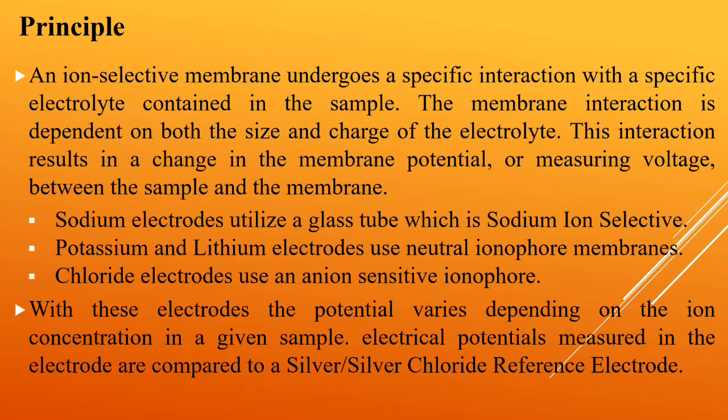The sodium electrode utilizes a glass tube which is sodium ion selective, whereas potassium and lithium electrodes use neutral ionophore membranes, and chloride electrodes use anion sensitive ionophores.